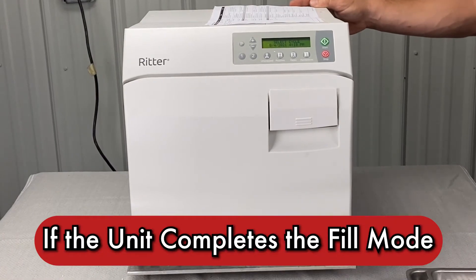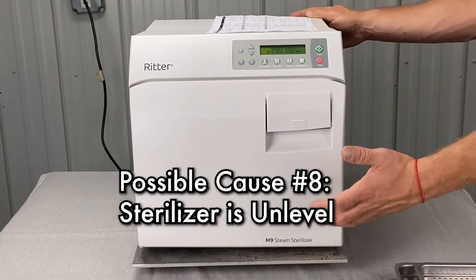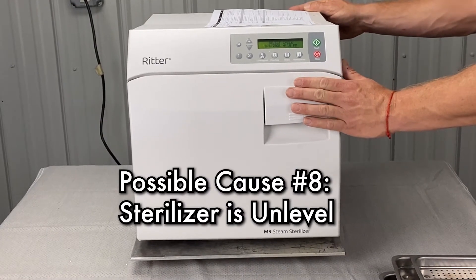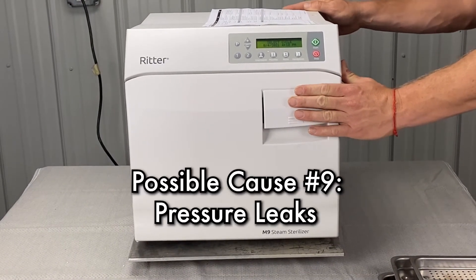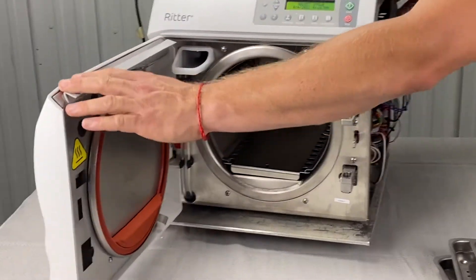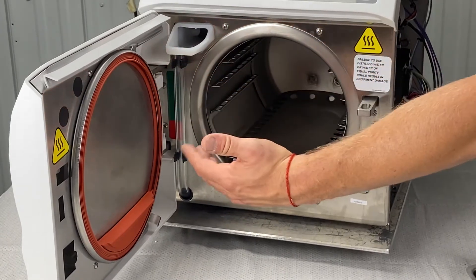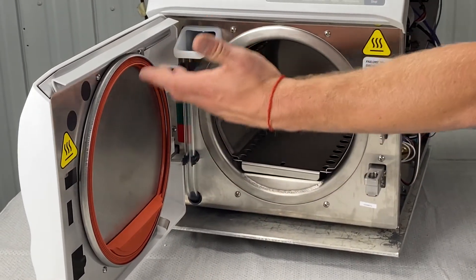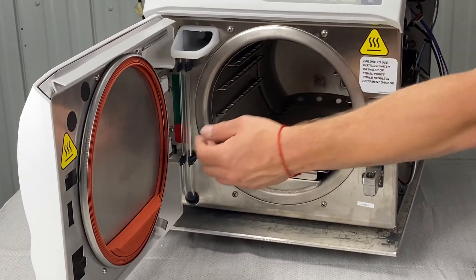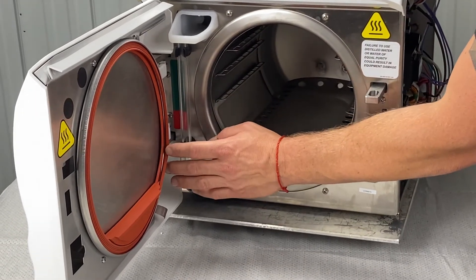If the unit completes the fill mode, we're going to verify that the sterilizer is level. Then, if you're running a test cycle, look for pressure leaks — worn door gaskets, worn dam gaskets, and improper positioning of those. If they are improperly positioned, put them in the right position and run a test cycle to see if the error persists.